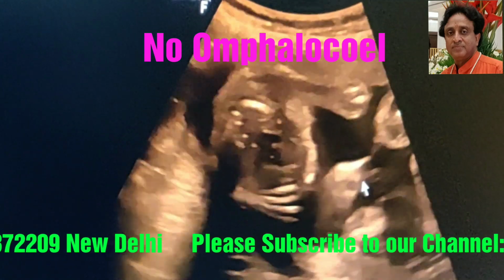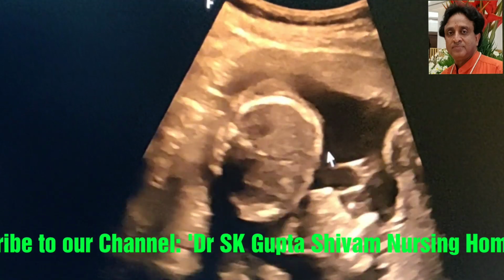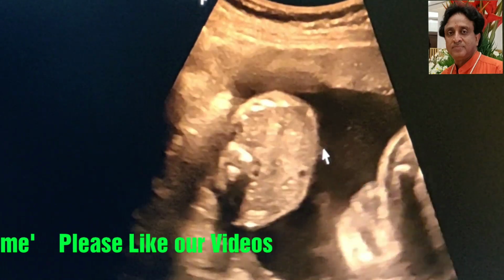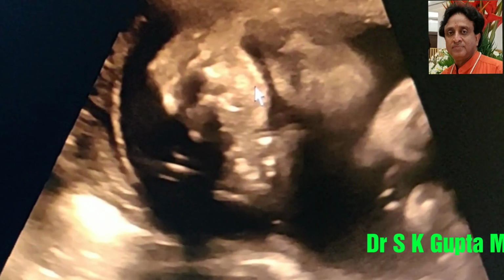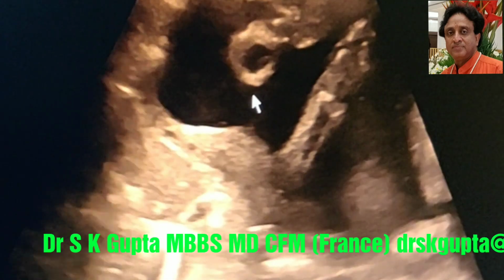And I try to show you the hanging brain. You saw that there was an upper lip which was normal. There was no evidence of cleft lip in this twin. This is the fetal frog shaped eyes and the fetal nose here. This is the fetal nose, and at times the fetal nose may be missing in these acrania fetuses.